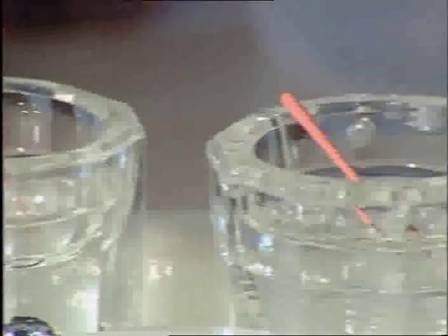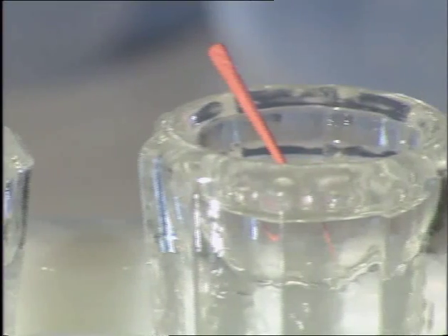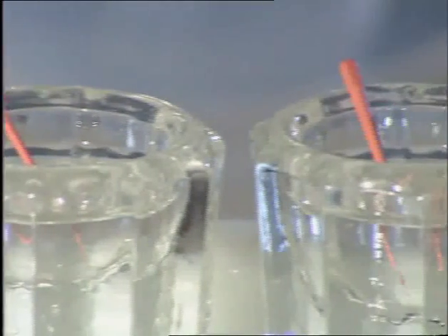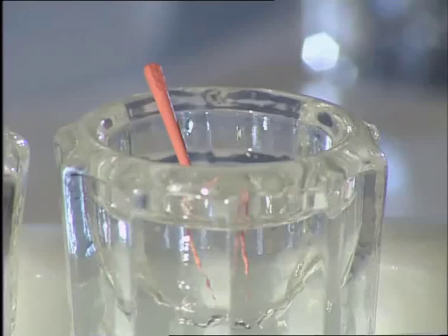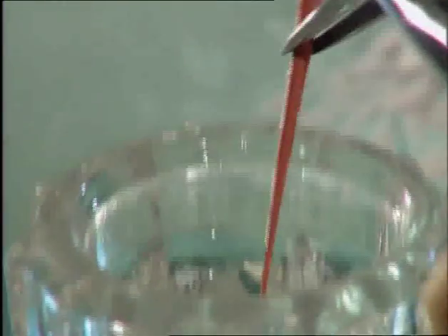The largest diameter plugger must work passively, unimpeded by dentinal walls over a range of a few millimeters in the coronal third. A smaller diameter plugger is chosen that can work effectively in the middle third, and the smallest plugger is selected that can work easily to within 5 to 7 millimeters from the canal terminus.